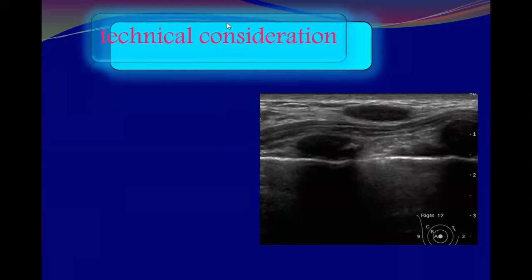Which one? The one above, in the breast parenchyma, because the two shadowing areas represent the chondro. What about this lesion? What about this? This is not a lesion. This is part of the cage of the.